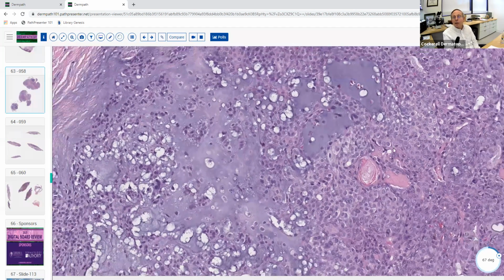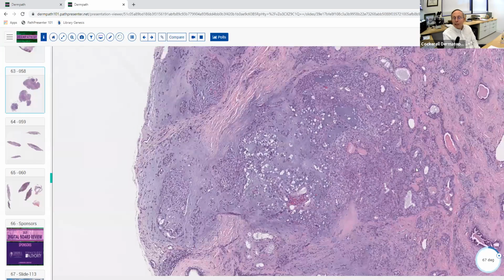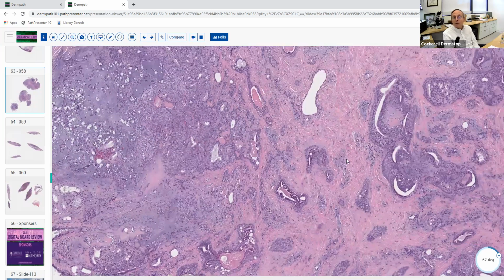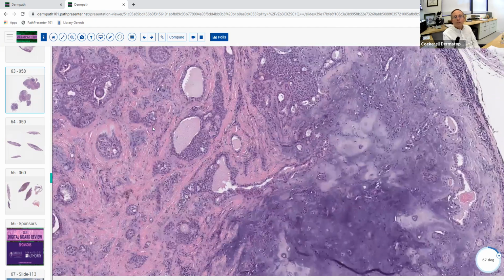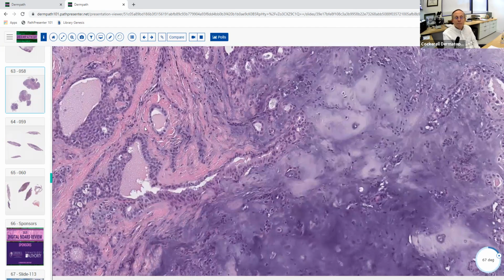Chondroid plus an epithelial neoplasm with ductal differentiation. So what's the correct diagnosis here? So-called chondroid syringoma. Chondroid syringoma, or also known as a cutaneous mixed tumor. And so again, the best answer here, we had adenoid cystic carcinoma, doesn't look anything like this. That basically gives you multiple small cribriform areas.